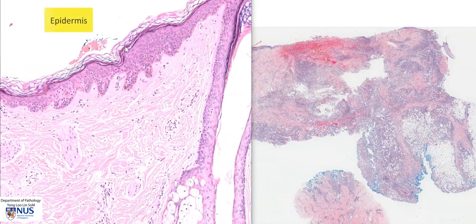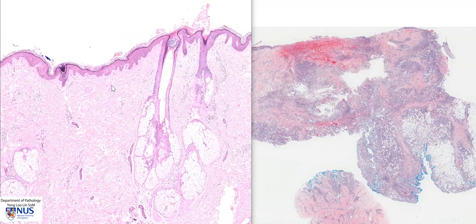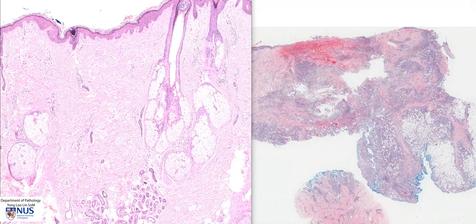On the surface, we have the epidermis, which is comprised of stratified squamous epithelium, which is keratinizing. So we have a few layers of keratinized material on the surface, and then below this, this whole pink layer is known as the dermis.